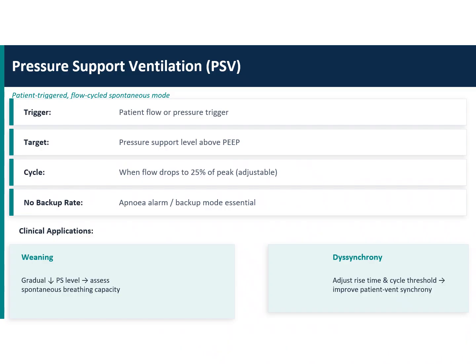Once you have intubated the patient, you are managing the patient, and the FiO2 requirement has come down, you have done a good treatment for this patient, and once the FiO2 requirement comes down below 50 percent or 40 percent, that is the time when you want to wean the patient off. It doesn't mean that you have to completely switch off the sedation.